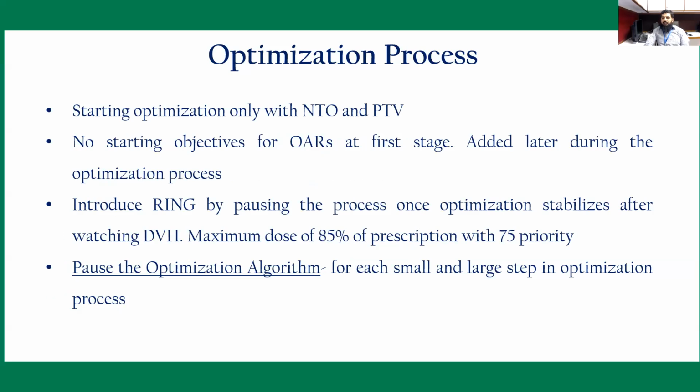So always start the optimization by defining the NTO and the PTV. Do not start the objectives for the OARs at the first stage. First, you have to run the optimization, and in between, you can introduce them by watching your DVH and how your coverage is going.